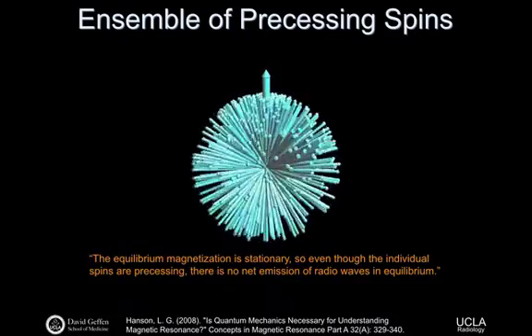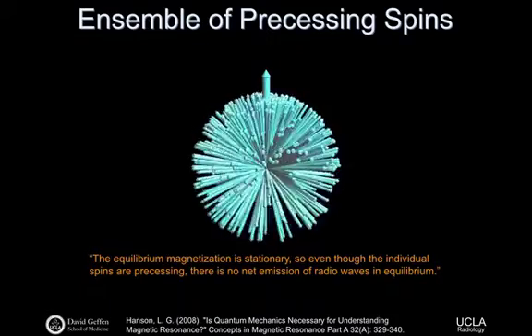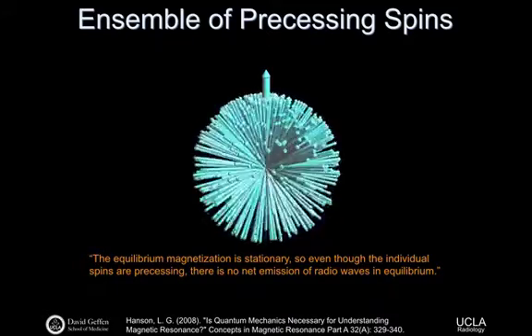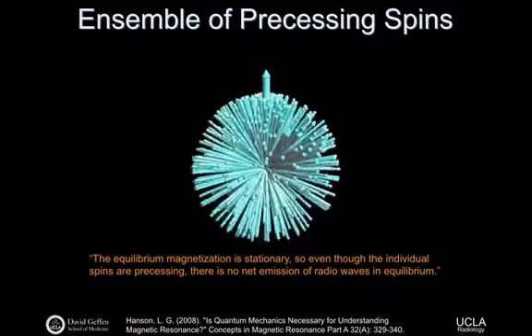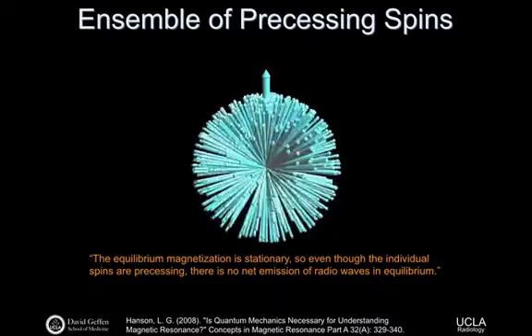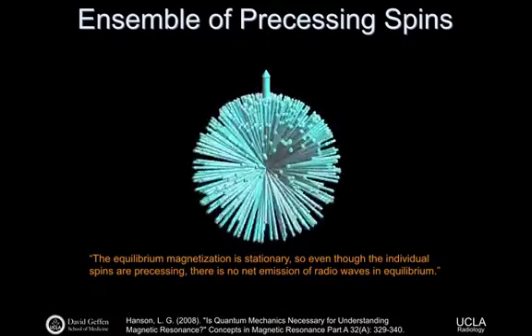So if you picture some voxel, some volume of interest that we care about, millimeters by millimeters by millimeters, you have Avogadro's number of spins in there. You can see he's done this carefully such that there's a preponderance of spins in the spin-up state, and it's slightly less dense in the spin-down state. And the consequence of that is we get a net observable bulk magnetization. That's this top vector that's pointing out. This is the M vector, if you will.